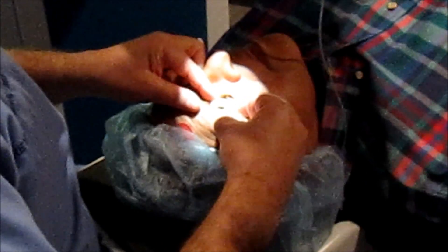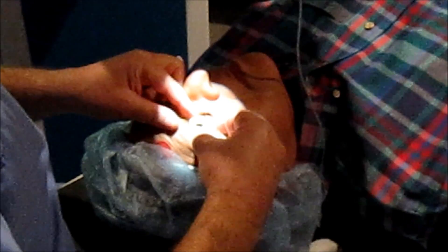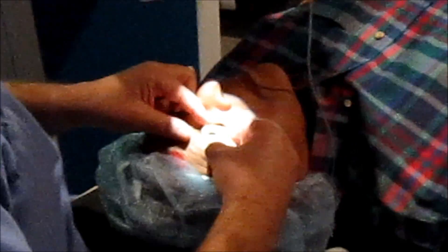First, we will put a vacuum ring on the eye. I'm using a lid speculum here, but you do not need to. The suction is very mild and the patient feels very little.